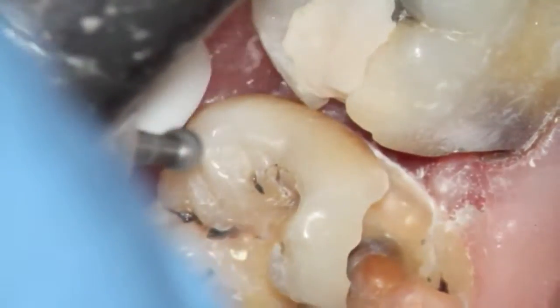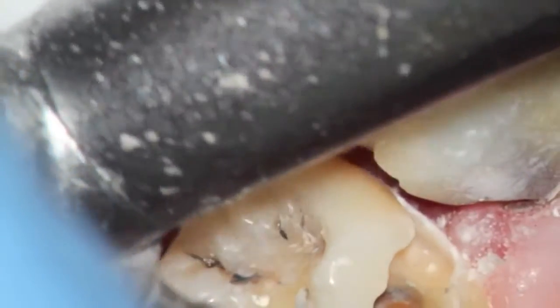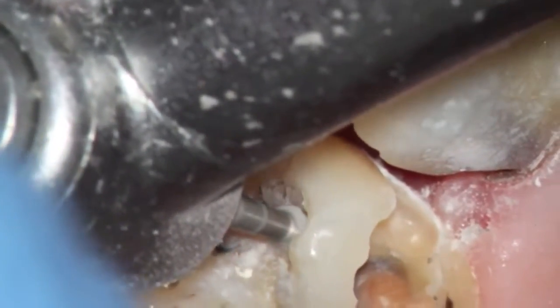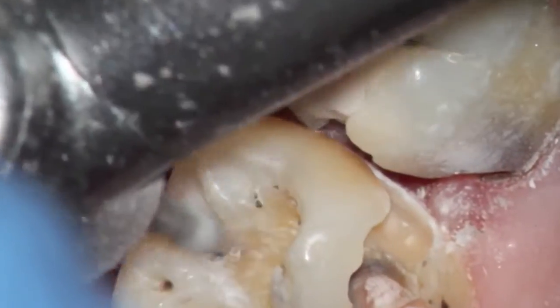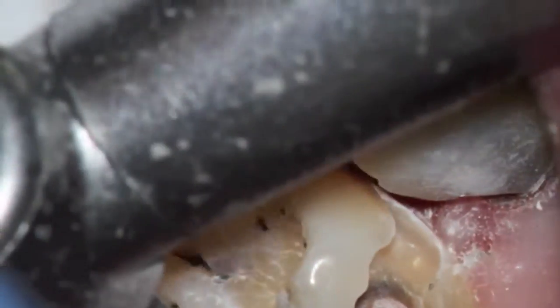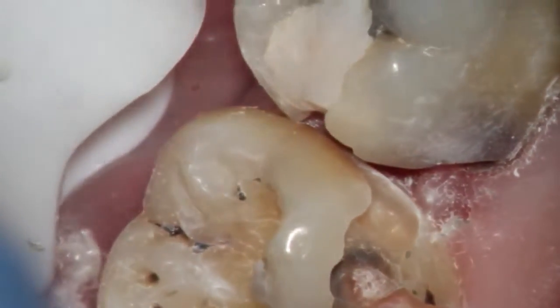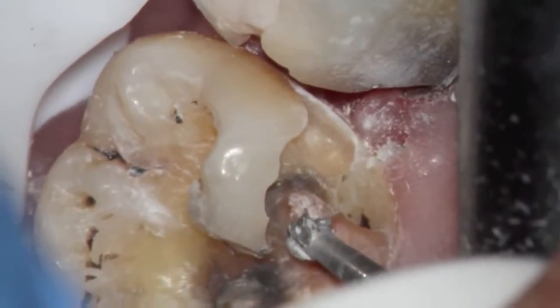Now, we've really pushed how well a tooth-colored filling will work in this area. And so this is truly a temporary procedure because a filling of this size that's tooth-colored just really won't hold up, and we'll need to go ahead and really recommend at some point soon to replace the filling with a crown.